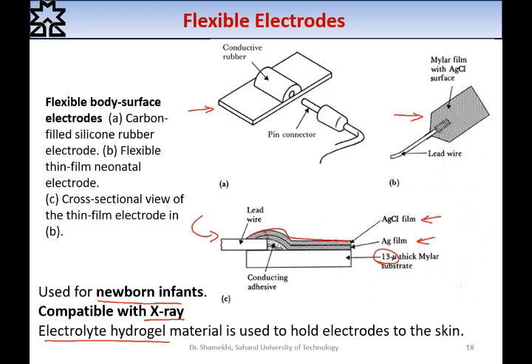We want to leave the electrodes on the skin of the newborn infants while imaging, because detaching the electrodes from the sensitive skin of newborn infants may hurt the skin.